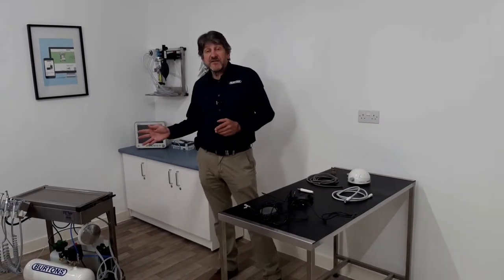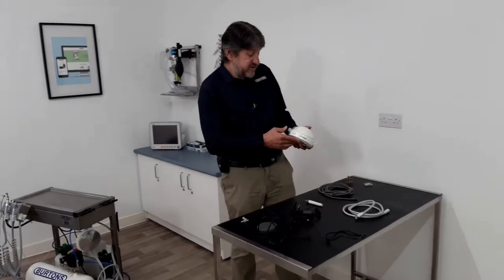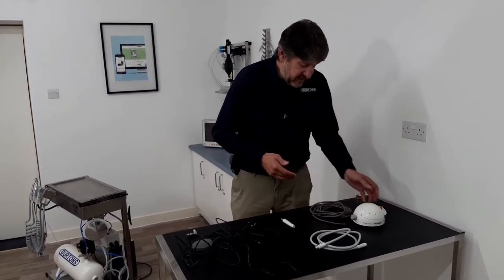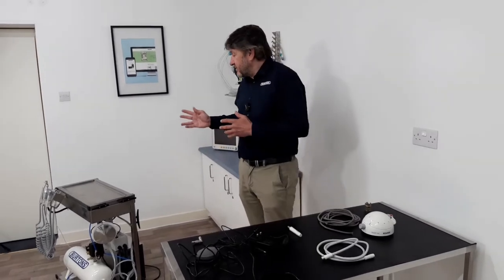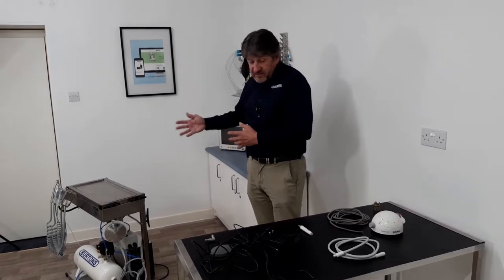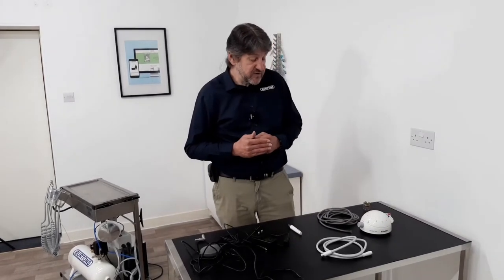Hi everyone. In this video I'd like to show how to connect a scaler to the Vetter Classic from Burton's. In this case we're using the Pison 150 scaler, however the procedure is the same for any scaler. The system is very adaptable in that the water supply to the main unit is also the water supply to the scaler, so no need for two separate water supplies.